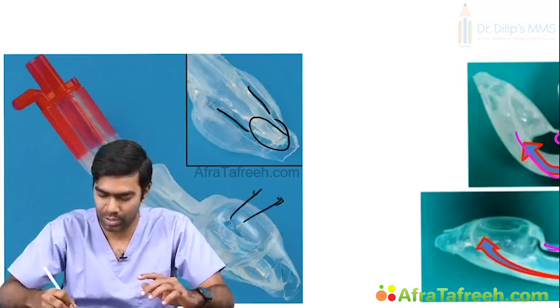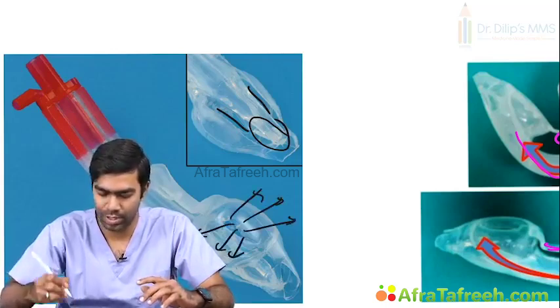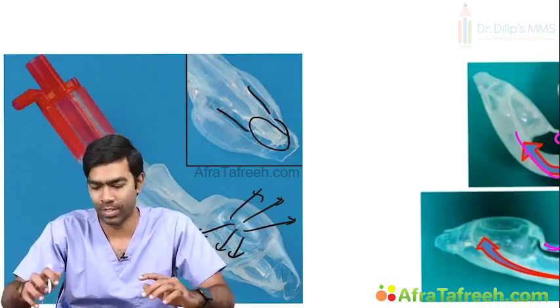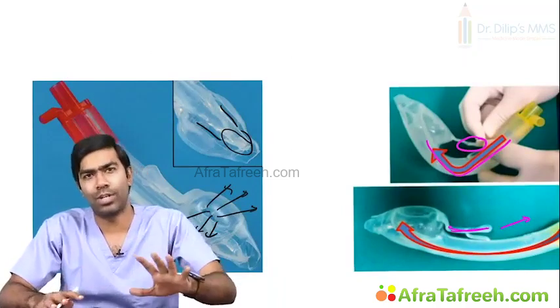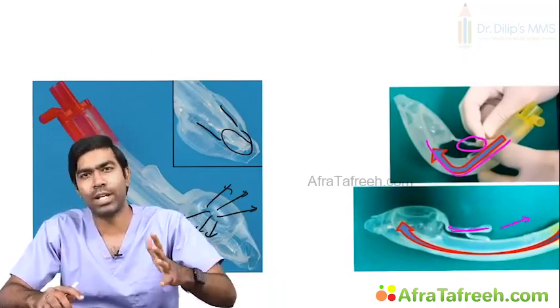And this is the ventilatory port through which the air comes out. Beautiful, isn't it? And remember, with this device, you don't need to intubate the patient. And no need actually.